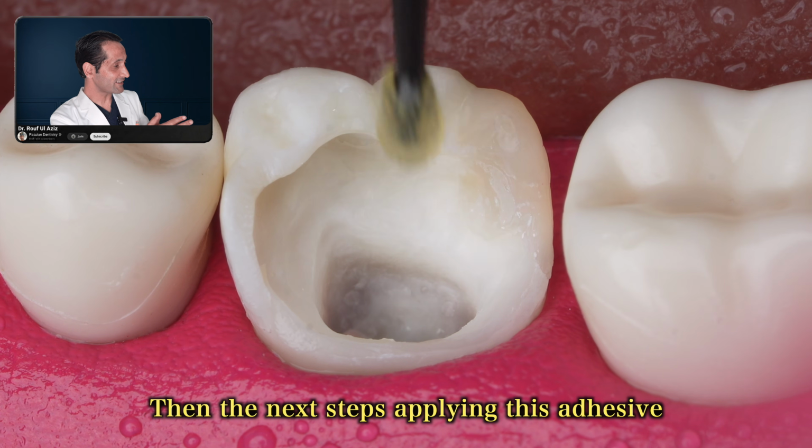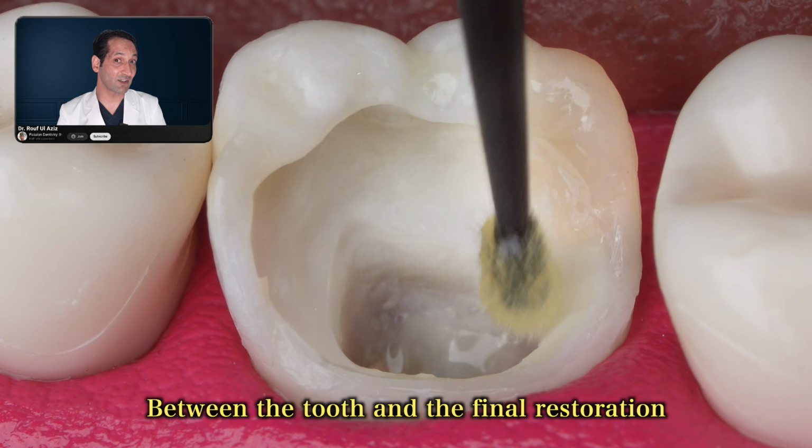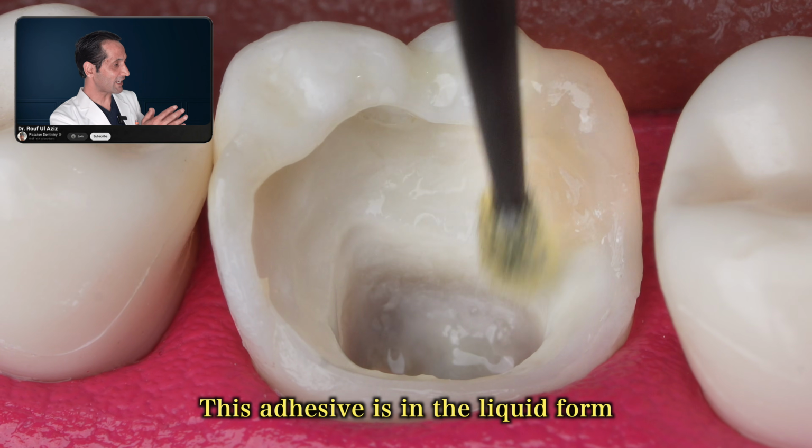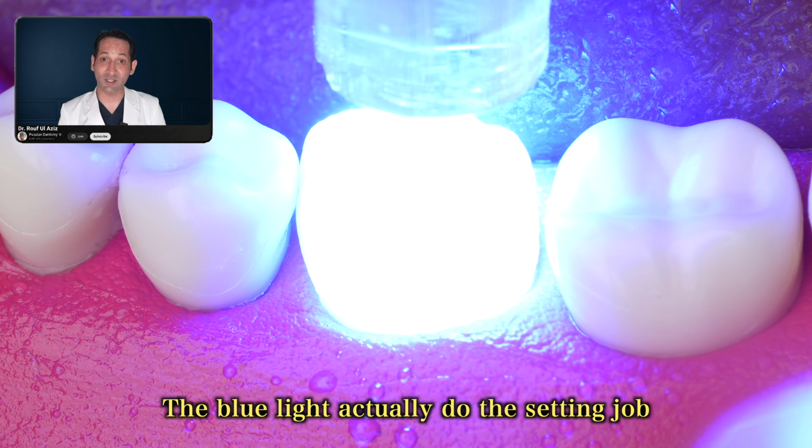Then the next step is applying this adhesive. This adhesive acts as a medium of bonding between the tooth and the final restoration. This adhesive is in liquid form and needs to be set using this blue light. The blue light actually does the setting job.